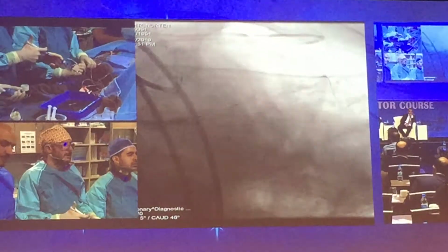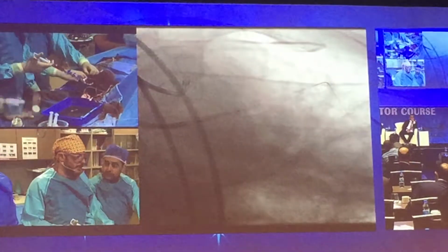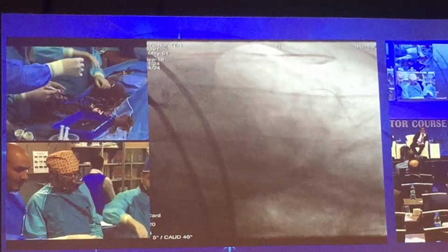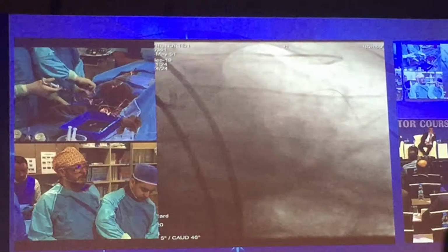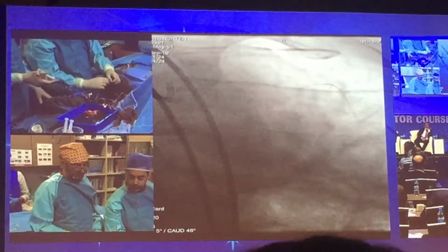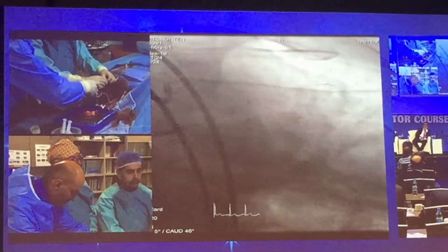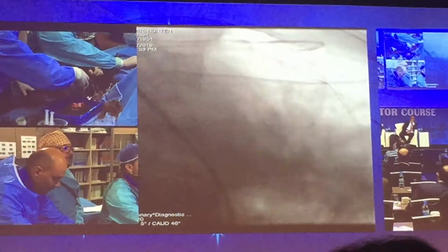Şevket abi, do you have the chance for IVUS for this patient? The panel is offering IVUS in terms of sizing of the vessel because this is a restenosis patient and sizing is important. Lütfen. Yes, of course. Our intention is also to measure the stent diameter and the vessel diameter with the IVUS. I totally agree. There was an under expansion of the stent. We also thought that the reason of the lesion is under expansion.